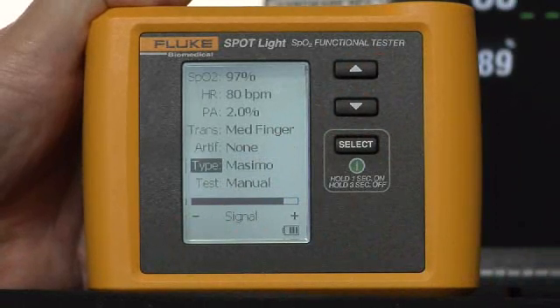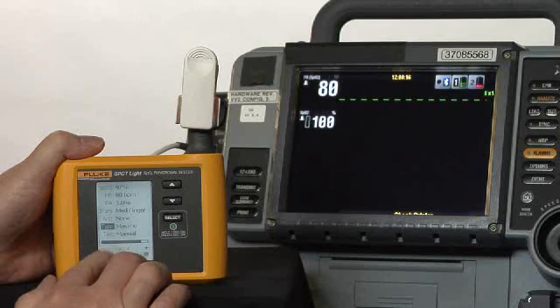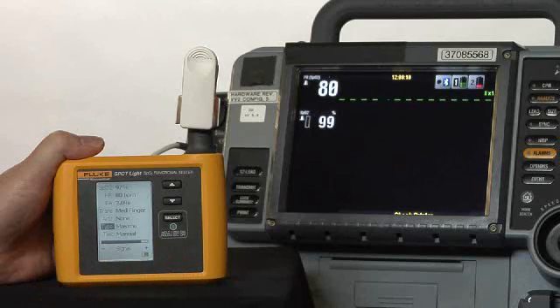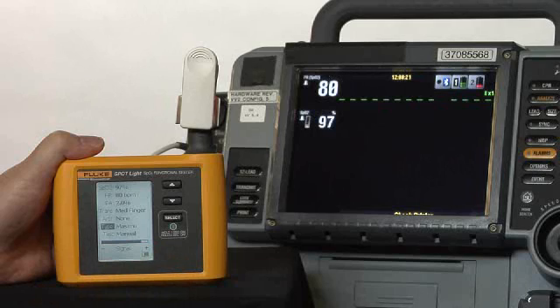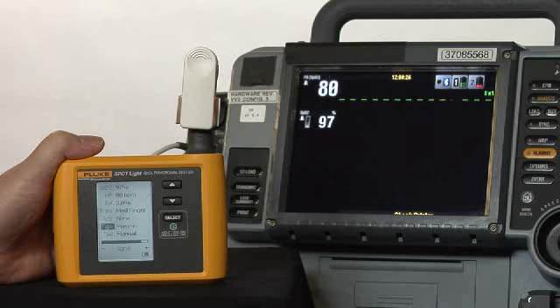And now all I'm doing is watching not only that I have a good signal strength bar at the bottom, but that the simulation values displayed on the spotlight match those values that are displayed on the oximeter part of the defibrillator.